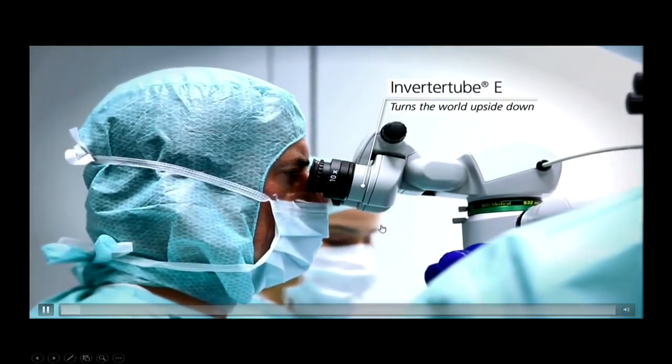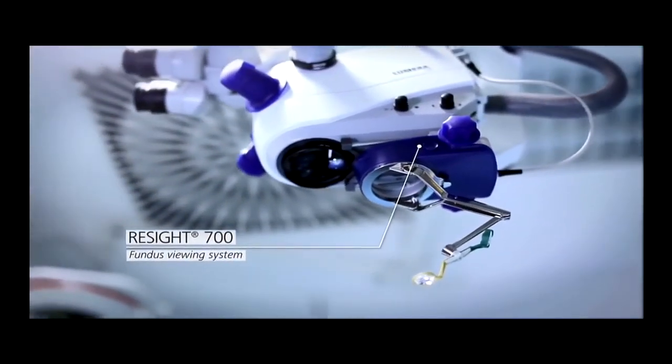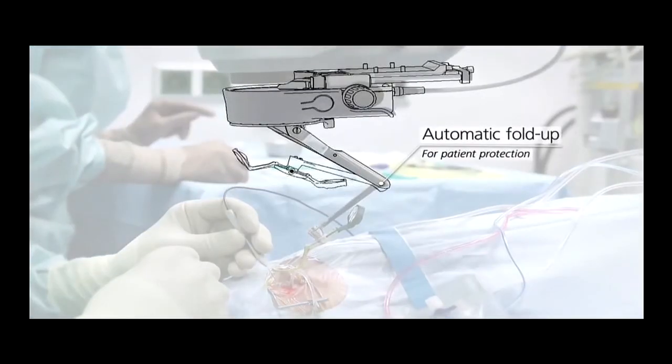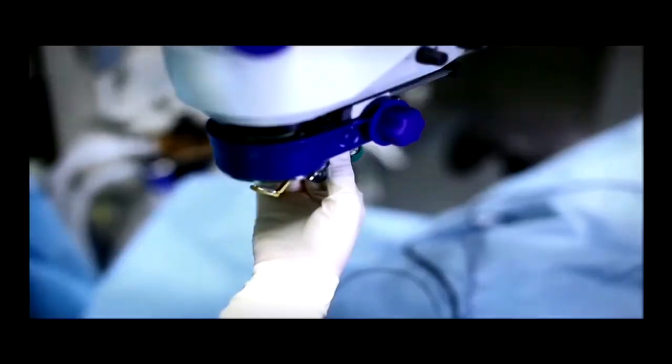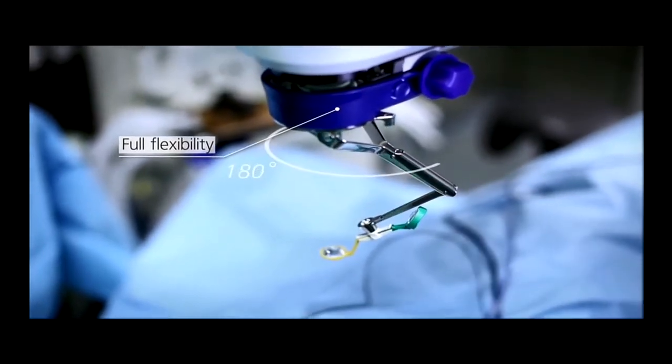So as soon as you activate the ReSight, the inverter gets automatically activated. The lens doesn't move up or down here. The lens is at a particular distance. This is only for patient protection. And you can rotate it in any direction that you want.